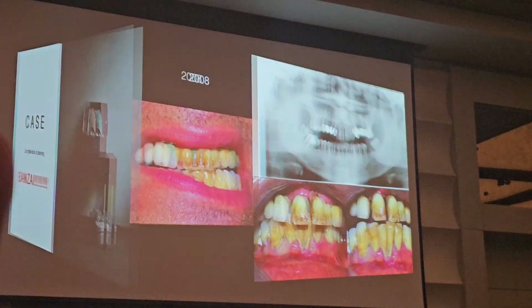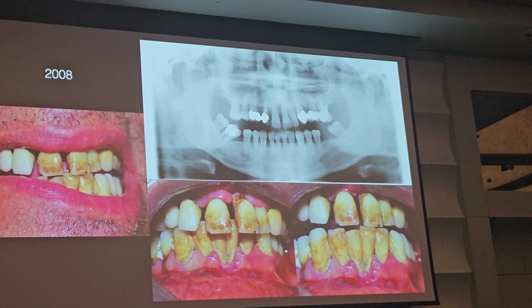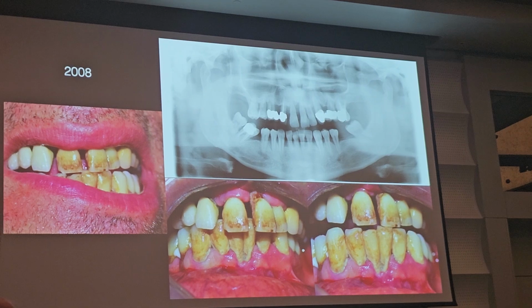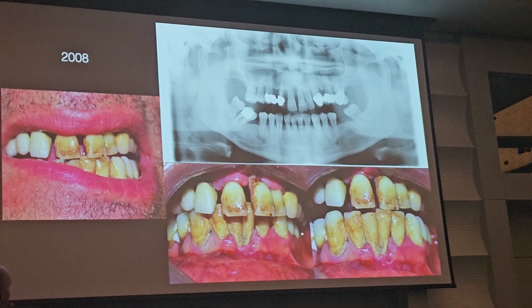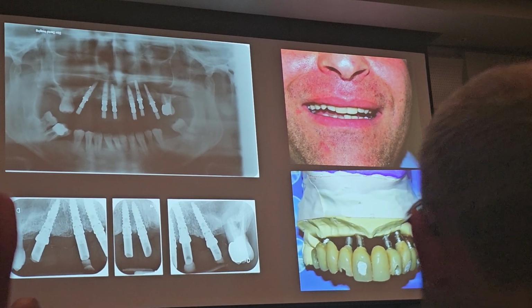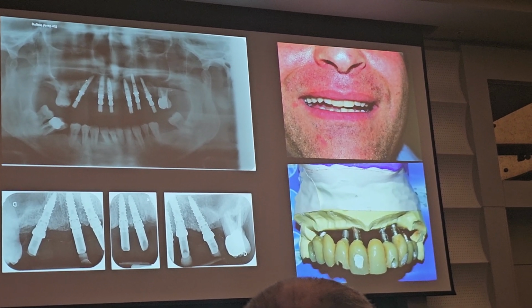So another banzai case. The patient came in this condition. I decided to do a full arch case by heart. I mean, with these photos, this panoramic, without any CBCT, the same day extractions and implantation, without mock-up, nothing. This is the provisional procedure. That's it. The implants are not so bad, honestly.